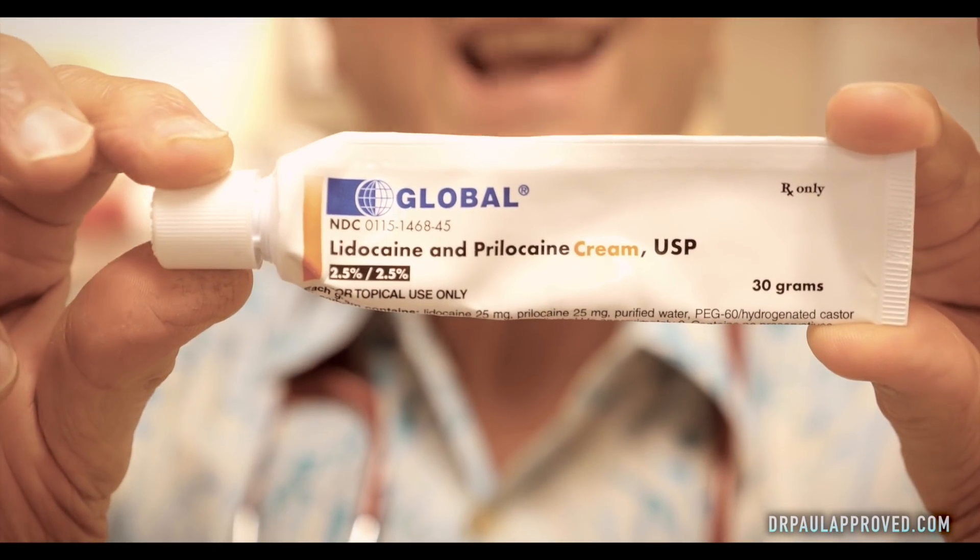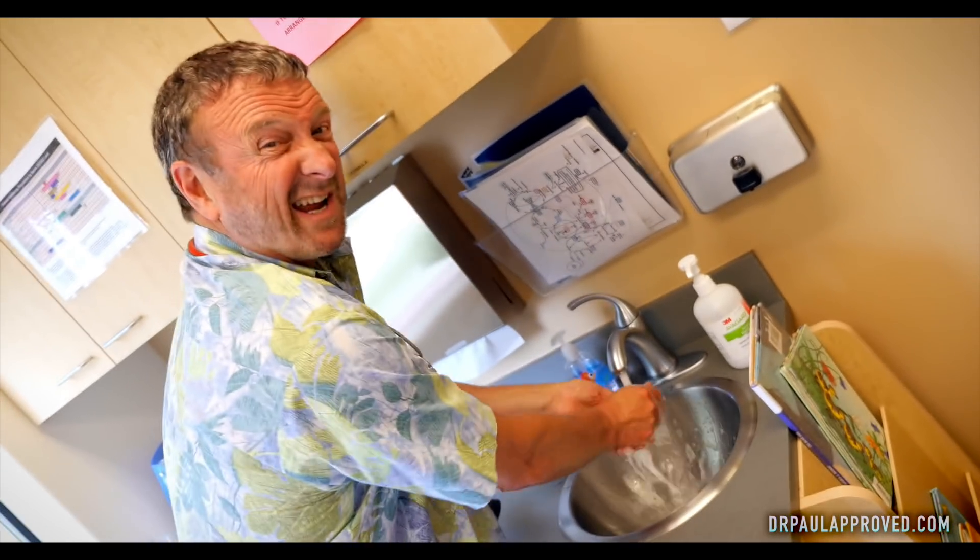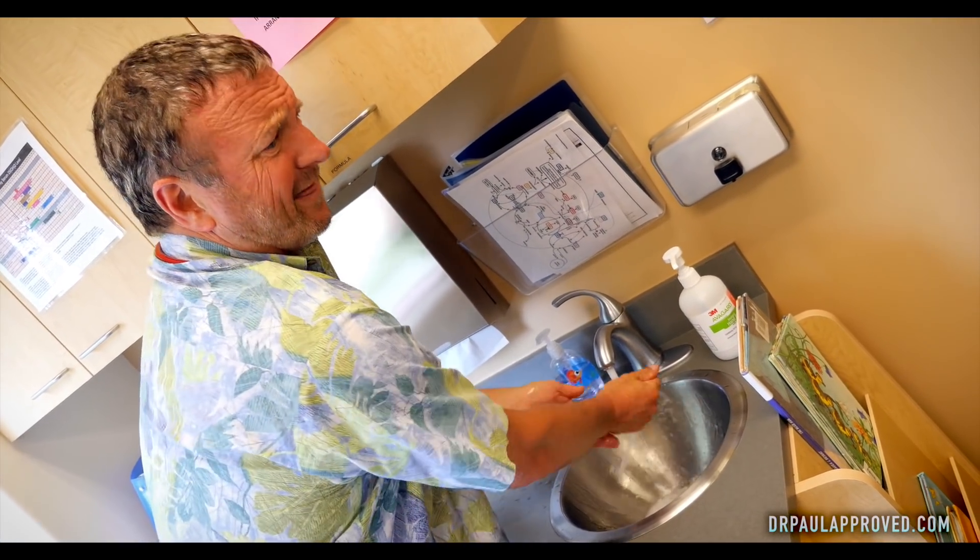This is lidocaine with prilocaine — just dab that on there. No gloves! It's alright, I'm gonna wash my hands. For my viewers, I wash my hands before and after every patient a thousand times a day. We'll be back to freeze that wart in just 15 to 20 minutes. We're gonna get some liquid nitrogen.